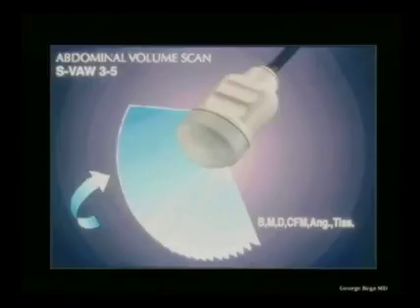The mechanical transducer, the dedicated mechanical transducer, is a transducer that is slightly bulkier because it has to house a small mechanical device that would have to sweep the transducer elements at an operator selected speed and an operator selected angle of acquisition.